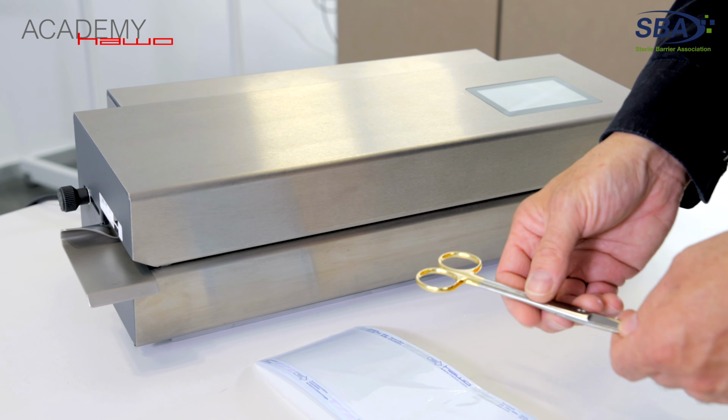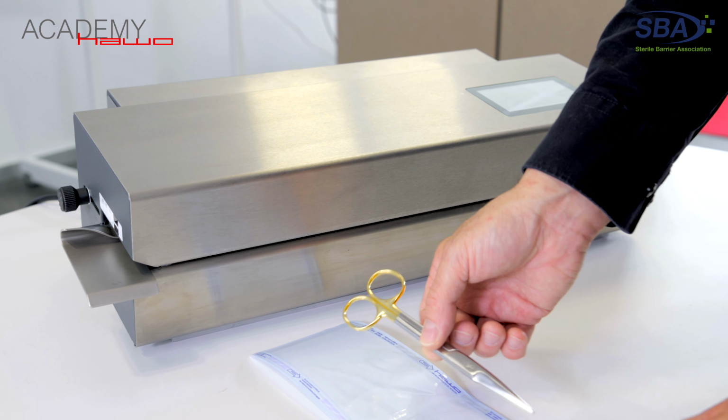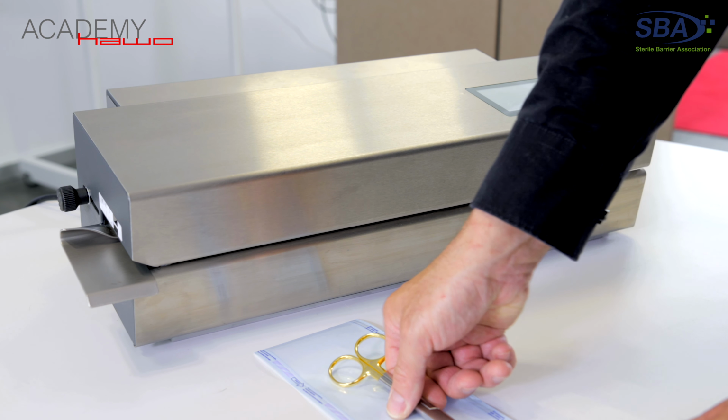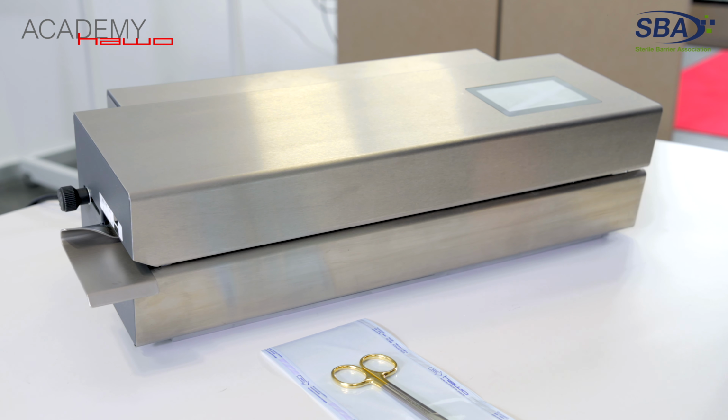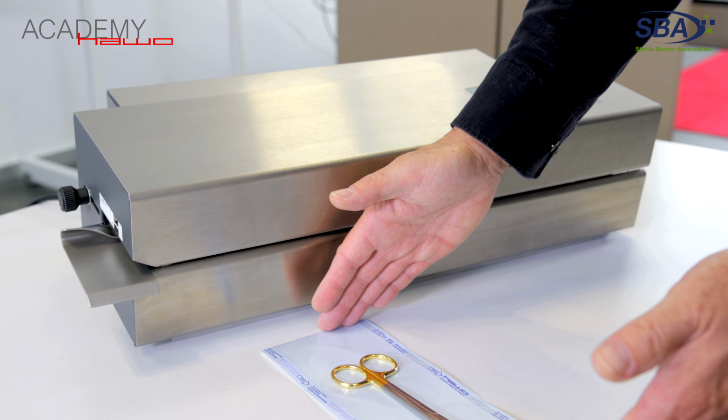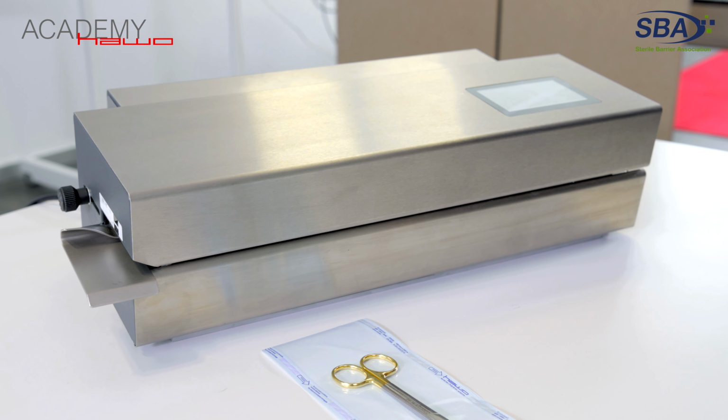For this demonstration, we have of course prepared something for you. Here, our medical instrument that you saw during the introduction, as well as a sufficiently long piece of sterile barrier system film, as well as our 950 with the printing options.